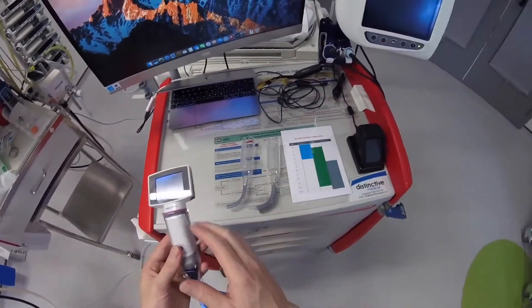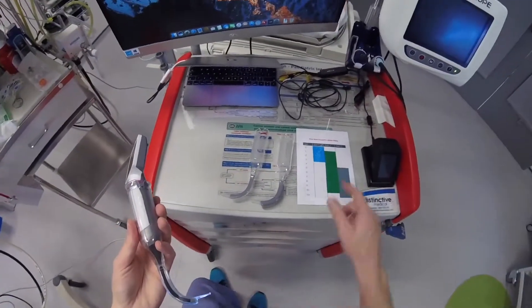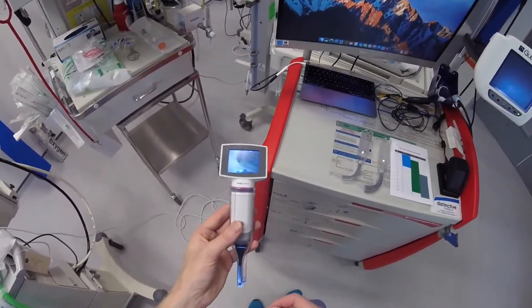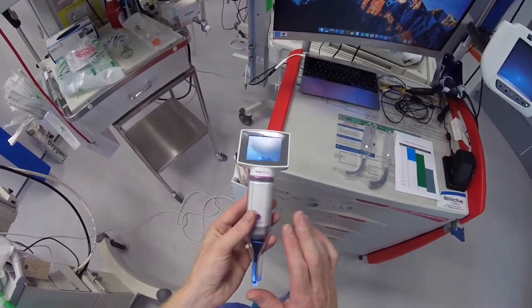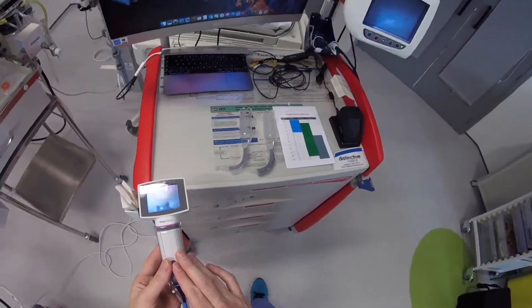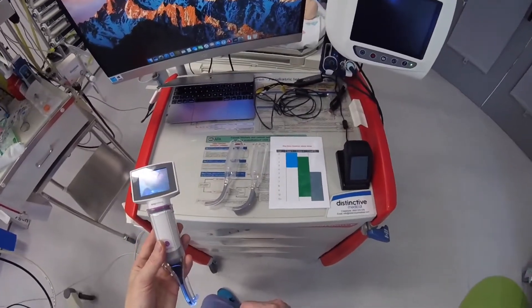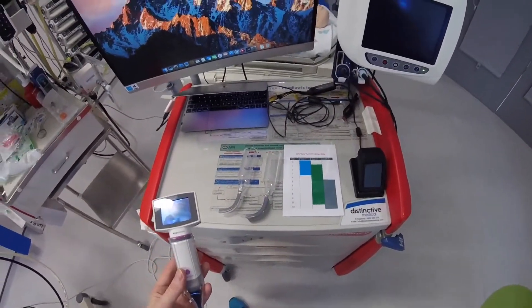So for children less than 1 year, you use the non-channeled type, and above 1 year of age, you have the option of a channeled or non-channeled blade. There is a bigger version of this video adapter that you can use with a size 3 blade, for children greater than 10 years of age.